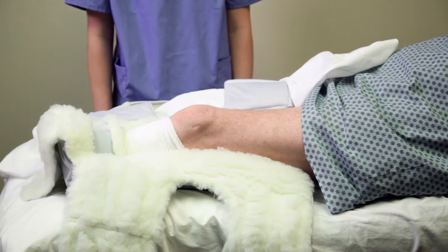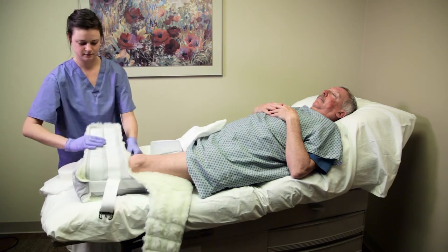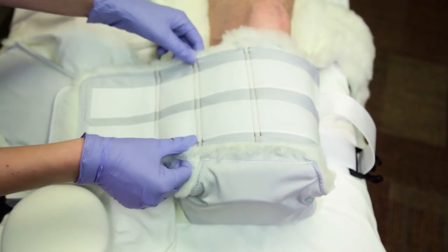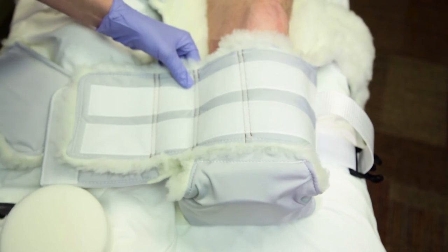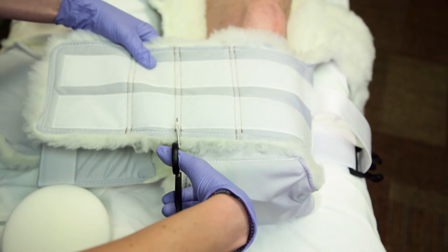Once the spacers are correctly placed, bring the tongue of the dressing up and secure it by closing the distal flaps. Included with each Rook BKA dressing is a pair of scissors that you may use to trim the flaps according to the patient's leg girth. Cut in between the double stitch lines on the dressing flaps rather than folding the material. This will prevent irritation on the healing limb and assure the fit is secure.